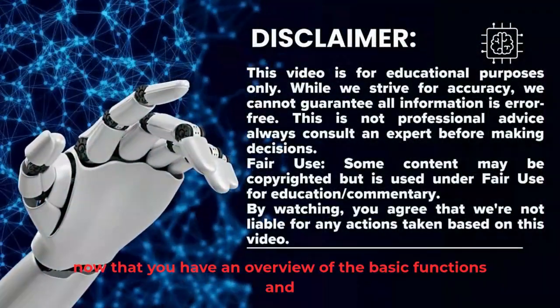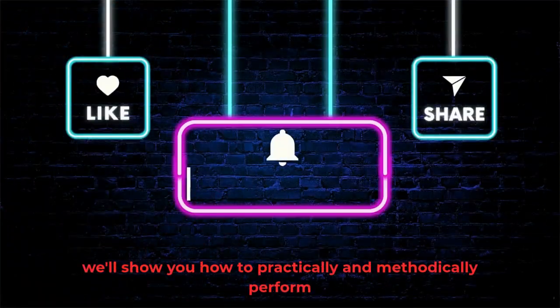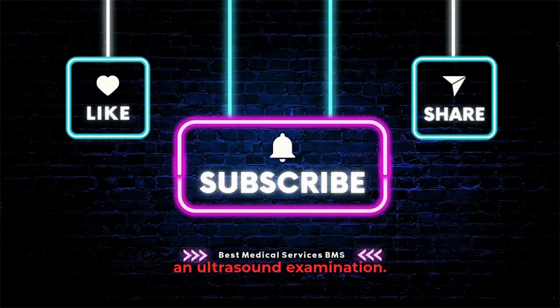Okay, now that you have an overview of the basic functions and settings of an ultrasound machine, we'll show you how to practically and methodically perform an ultrasound examination.